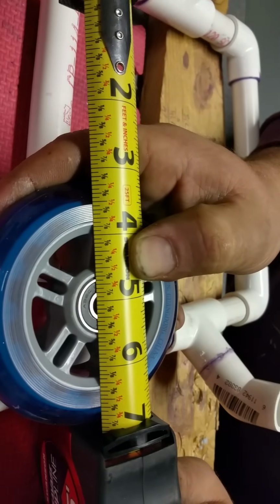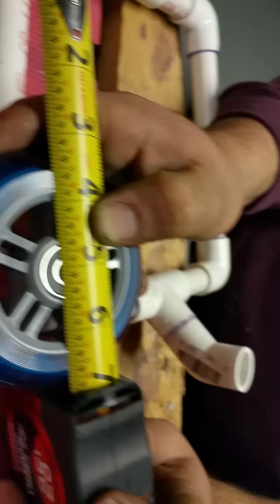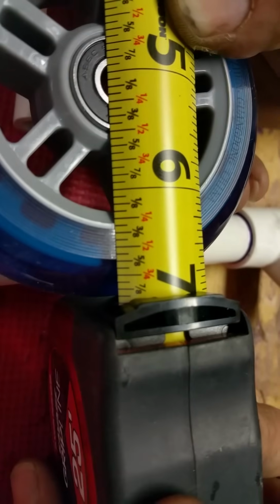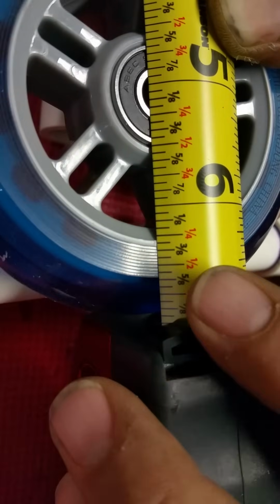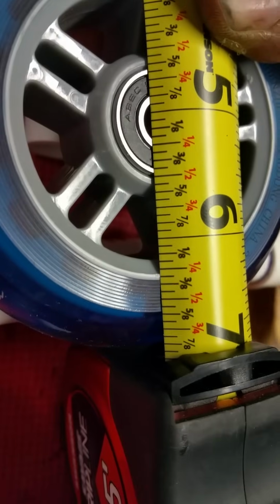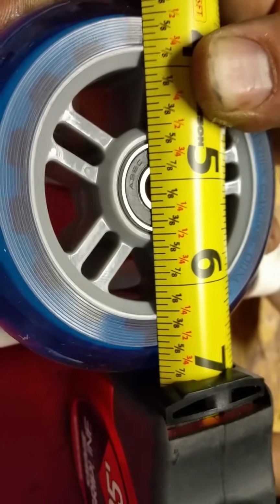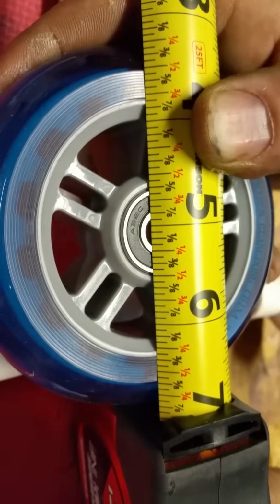Okay, so for this 7-inch height for a Dachshund cart, we still have the 2.5 inches that the leg is making up. And if we look, the hub sits at 5 1/8. And if we go to 6 1/4, that's a reasonable place to stop, because we don't want the PVC to scrape on the ground, so we need to leave room. This also leaves us a little bit of room so we can adjust up one hole in case the height isn't exact from the measurements or the dog isn't sitting comfortably.